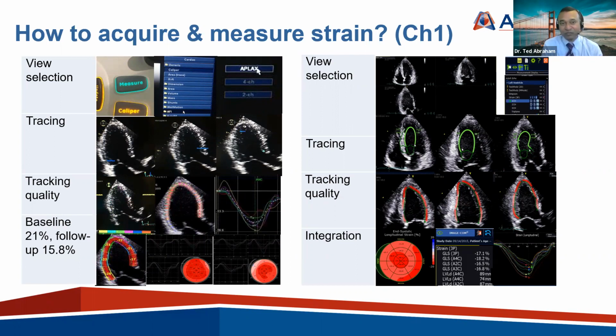So we have at least 2, I would say, master's level sonographers who know strain inside out and can do a fair amount of analysis and put that up in the report, because although we do have a system that can get into the report, get into the raw image, we like to have it all done on the machine if possible. And then we have a group of 5 or 7 sonographers who are, I'd say, second tier folks who do a fair amount of strain. And there's a lot of feedback with every case almost.